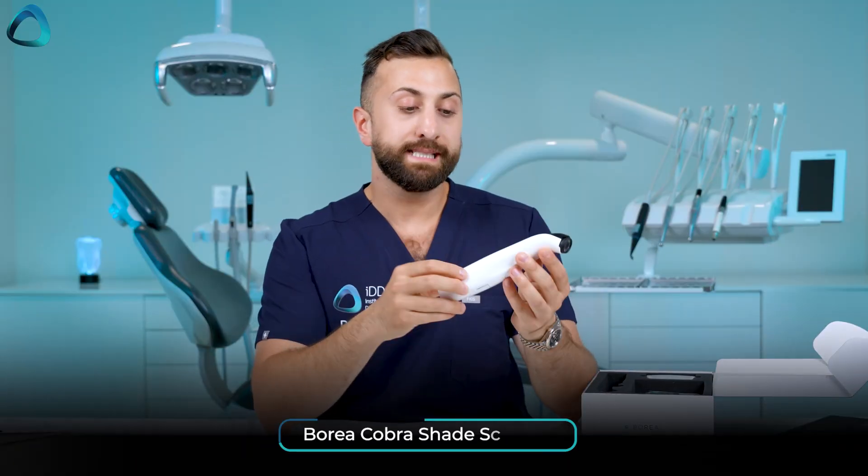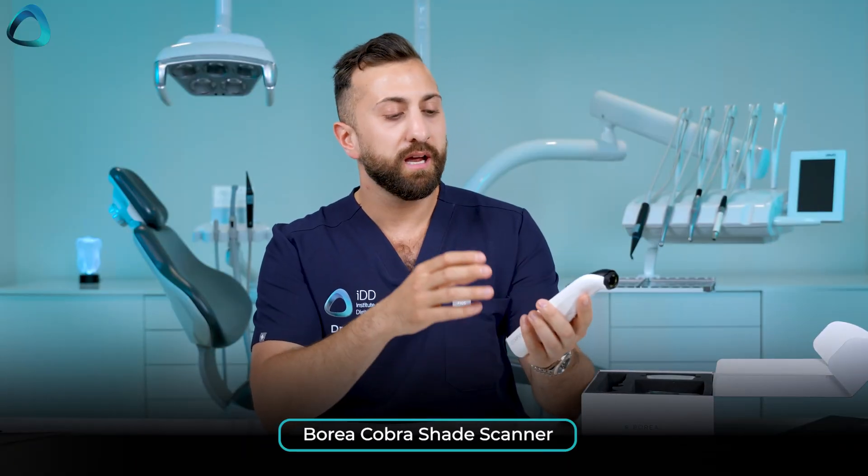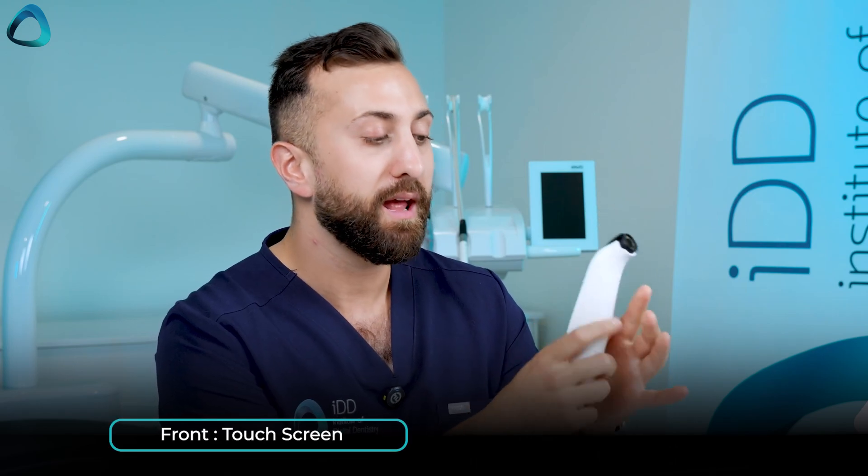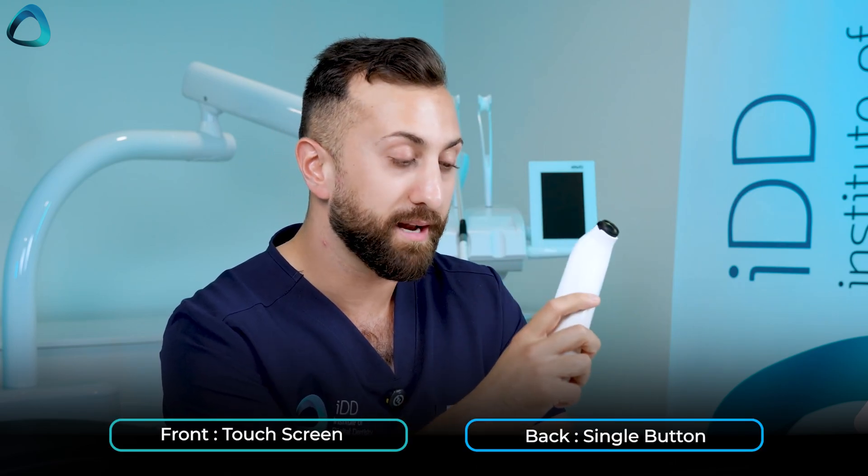Right underneath we have a few other things. The main thing is the Borea Cobra unit itself — a pretty sleek, modern-looking design. It weighs around 169 grams, so it's pretty lightweight. It has a touch screen on the front, and on the back a single button which is used to take shade detections.